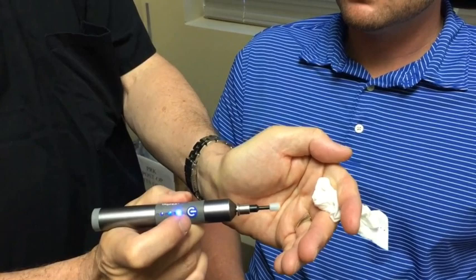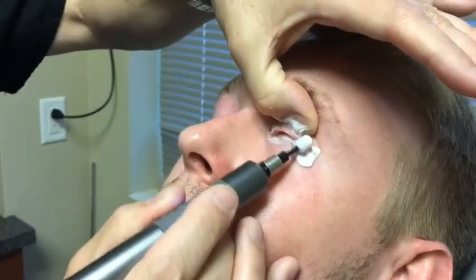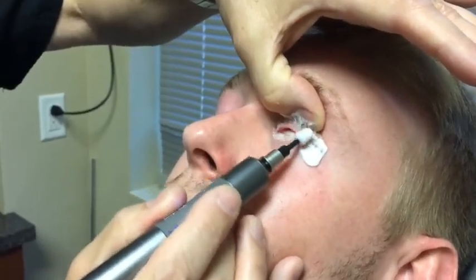So we're going to record a definitive step-by-step BlephEx procedure video that really outlines the do's and don'ts of performing a proper BlephEx technique.